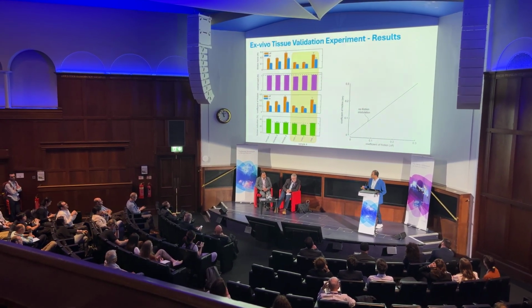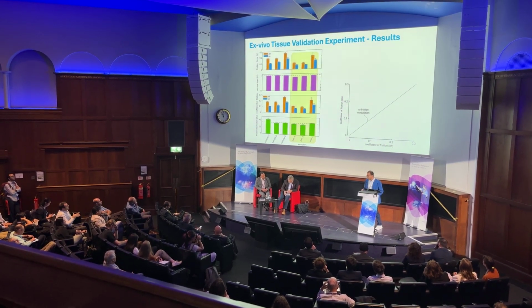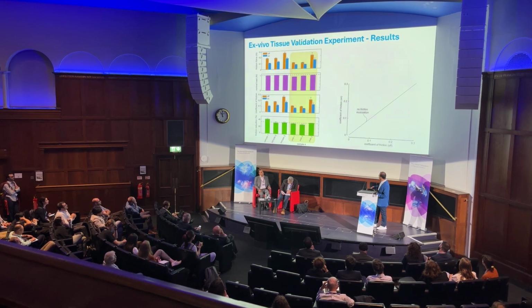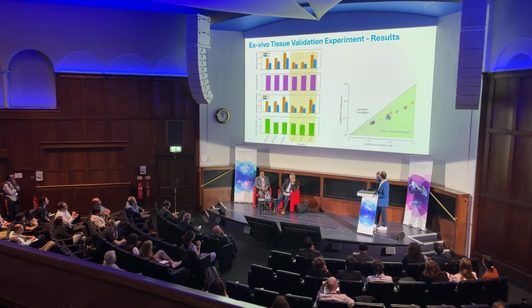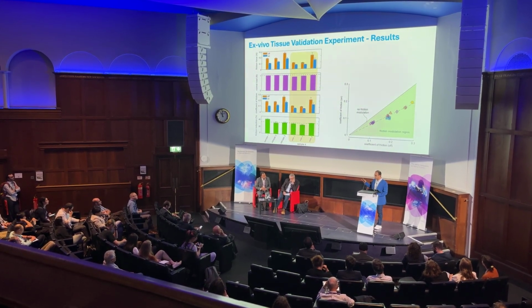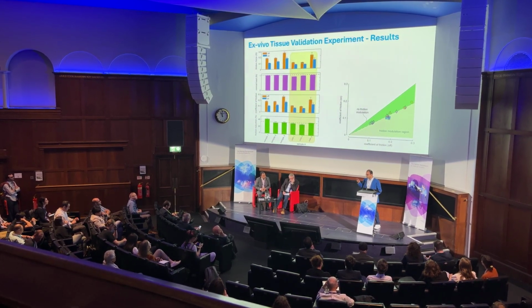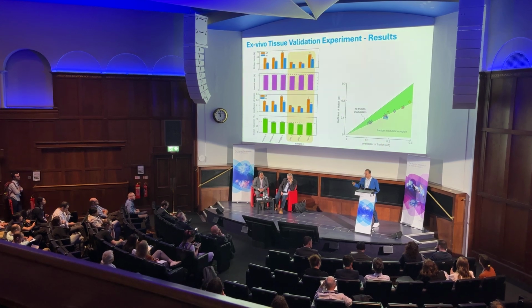We were able to achieve 38% friction reduction across all samples on average. And if we look at the relation between the coefficient of friction after we activate vibration versus the coefficient of friction before we activate vibration, this line represents no friction modulation. Once we start vibrating, we get into this friction modulation zone. And we found a linear correlation between the coefficient of friction in the off case versus the on case, which basically tells us that the range of friction modulation depends on where we start in the off case. So basically we need to start from a sticky design and then vibrate to get a bigger range of friction reduction.